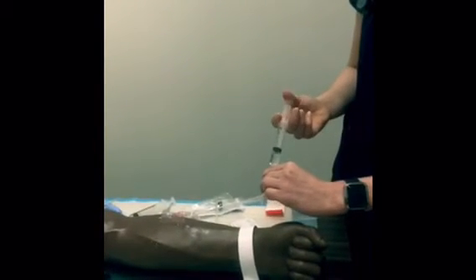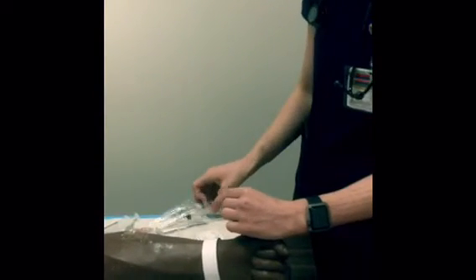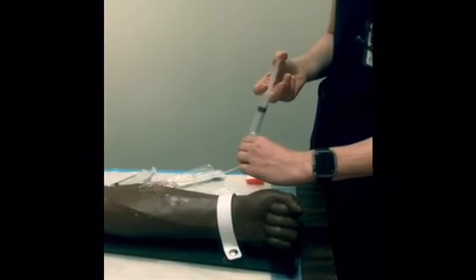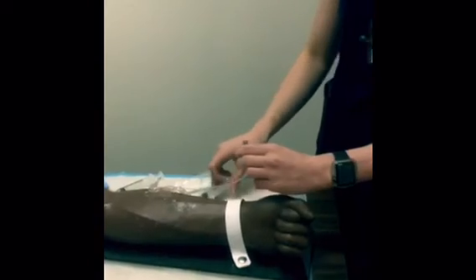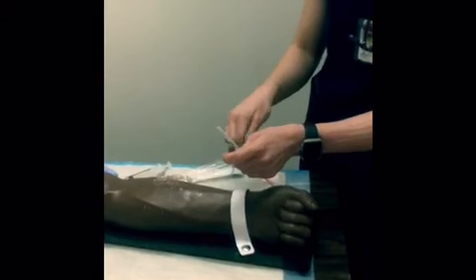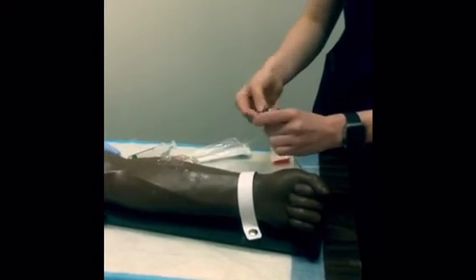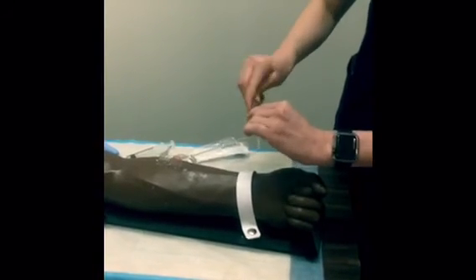So 2 minutes have passed, the medication is in. I'm gonna take that off and we're gonna do one more flush before we get you hooked back up to your maintenance fluids. So that flush. All right. And then I'm gonna wipe off this also before we get you attached because I just had that laying down. And make sure we get that good and clean. Okay. And hook it back up.